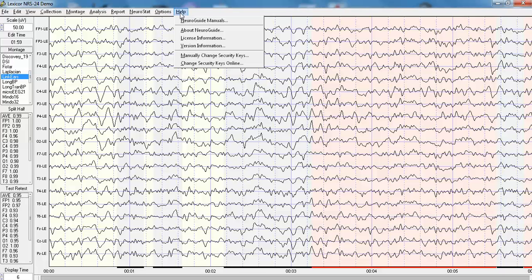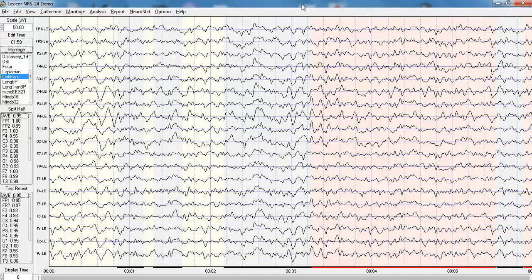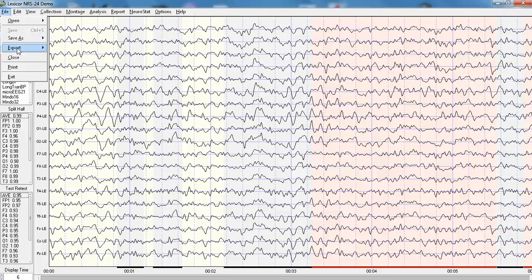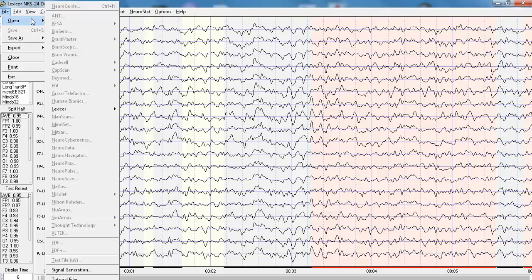And this is from Lexicor with a patient with right parietal lobe damage. And you import that data by clicking File, Open, Lexicor, and import the data.